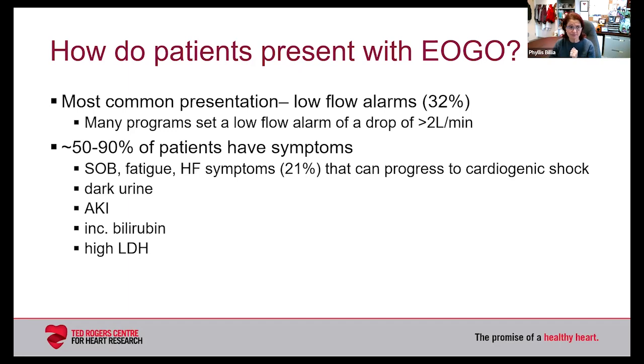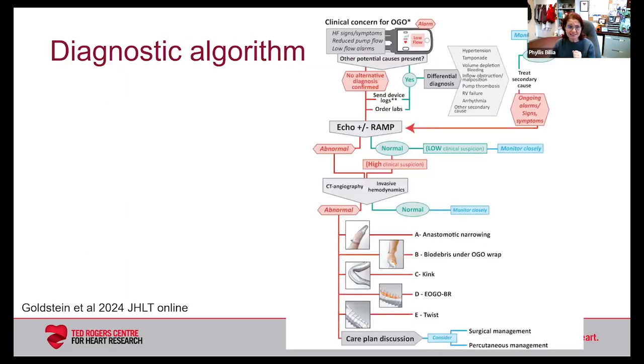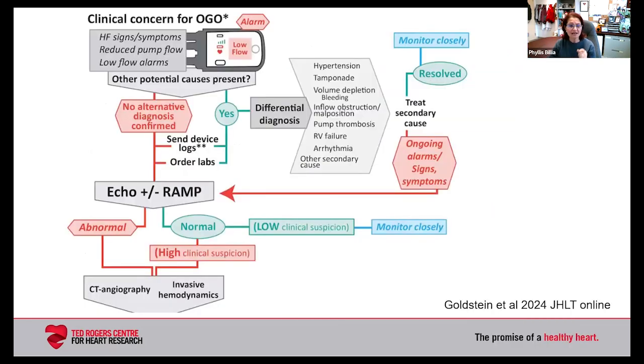If we go back to that state-of-the-art review, it shows a diagnostic algorithm which puts it all really nicely together. Let's focus on the first part of the algorithm, which is the clinical presentation, because that is important, meaning understanding the acuity and the severity of the change in LVAD flows, and also having a sense of the degree of residual cardiac function. The range of presentation can be from an incidental finding to extremes of shock or a major arrhythmia.